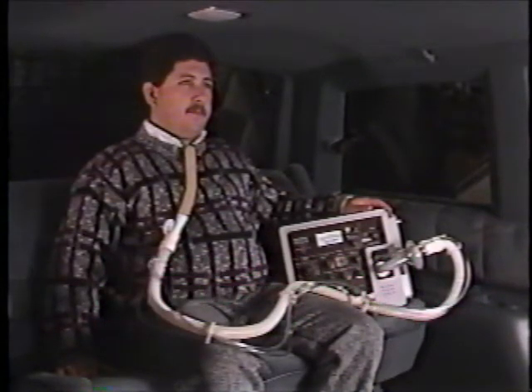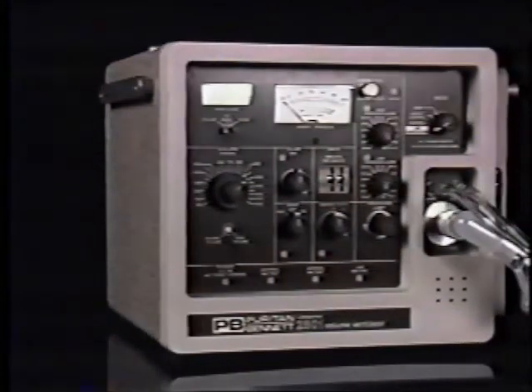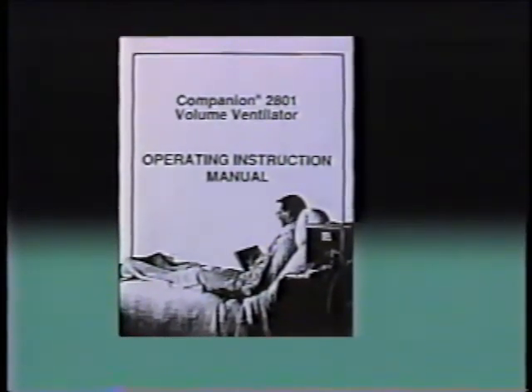An internal battery provides power for up to 1 hour for short-term transport applications, as well as emergency power supply. The purpose of this video is to familiarize you with the controls and alarm functions of the Companion 2801 volume ventilator. For a more complete description, refer to the operating instruction manual.